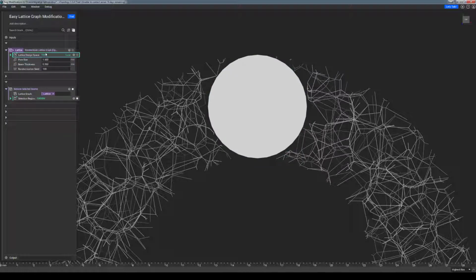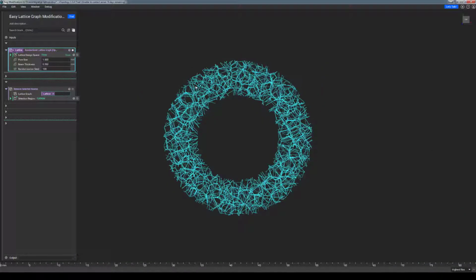Next up, we have a Trim Lattice Beams block. And this custom block actually does truncate the beam up until the boundary of the selected region. So using this same cylinder, any beam that is impacted by this block will be shortened, but not entirely removed.